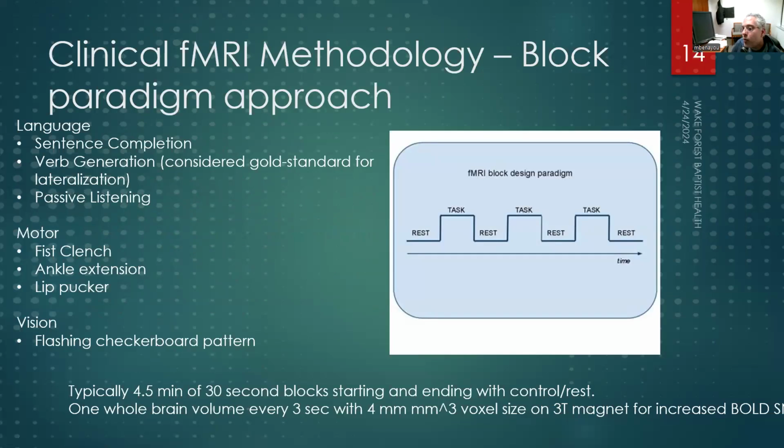I don't know that we know why, but a lot of times what people will do, and actually I've seen some disagreement lately, that maybe sentence completion's better. But we don't really know why, but there's a lot of things where you can do MEG and other gold standard methods. Actually, the gold standard is intraoperative recording.